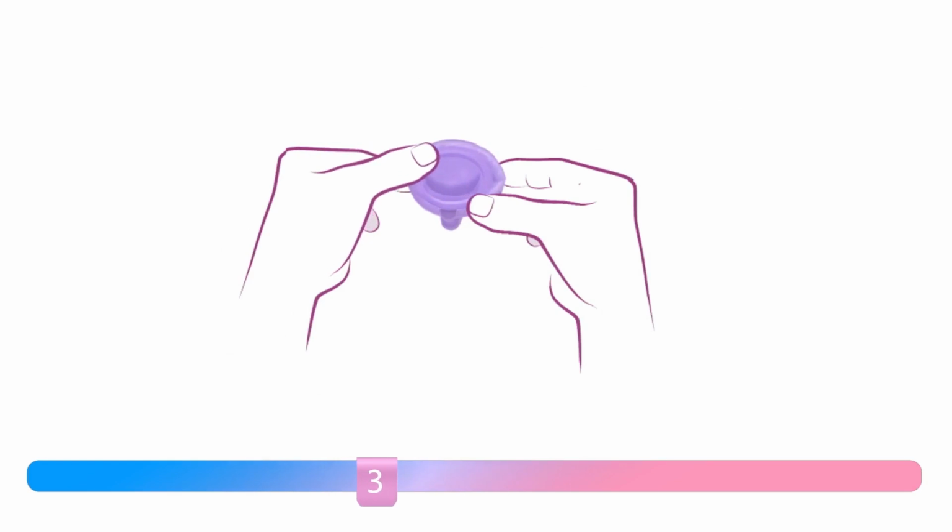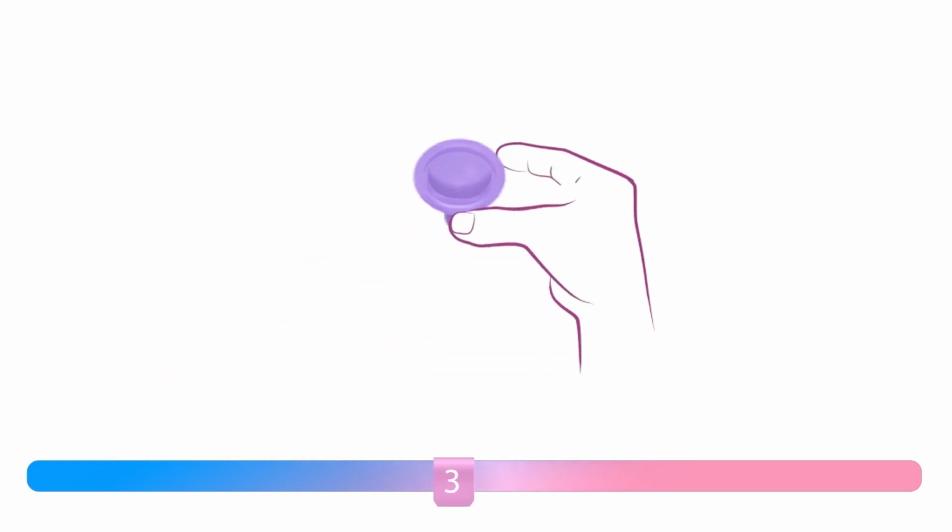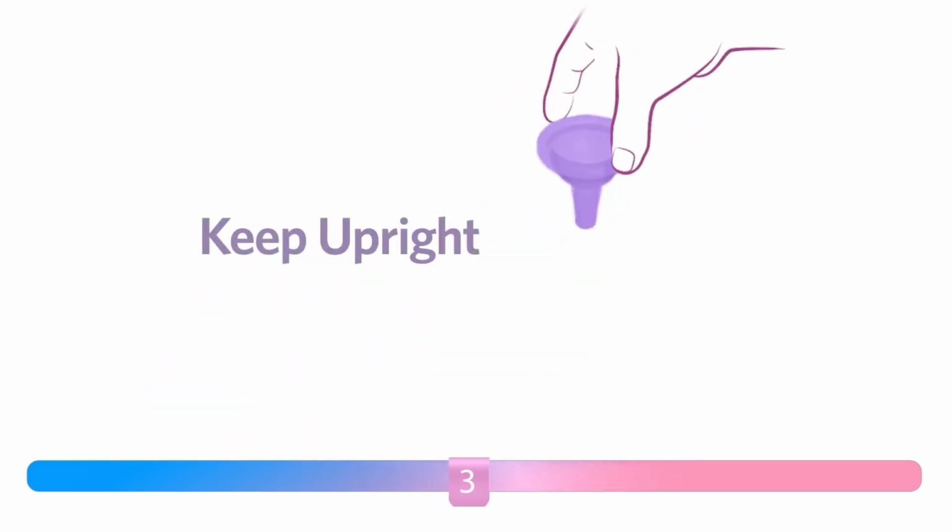Separate the cervical cap by pulling outward on the condom roll while pushing upward on the outer rim of the cap. Always hold the cap upright, touching only the outer surface. Extract the cervical cap, keeping it upright.